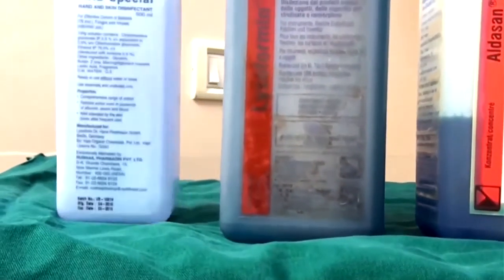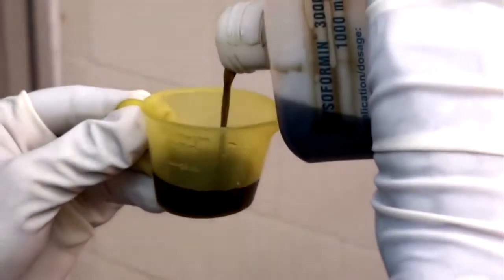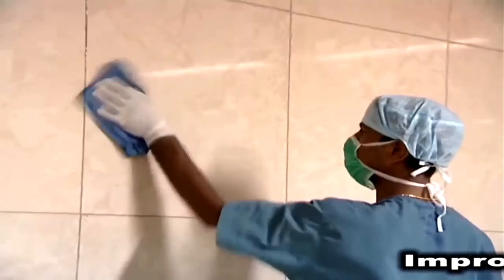So these are some of the cleaning agents we use in the theater. A common mistake we make is we pour a little like that and dilute it and use. So always measure the quantity of the disinfectant you're going to use so that you get the proper dilution.